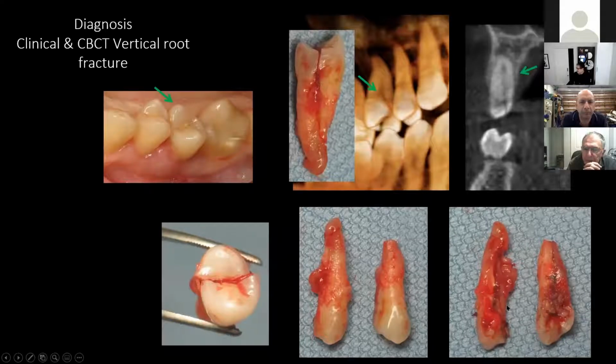So the issue was that the patient was promised, look, go to Dr. Narbani and he will place an implant for you, which I'm happily doing. I'm always grateful that we get referrals coming through the door and happy to look after our patients. But my question is, could this have been prevented? You see, this is why diagnosis and treatment planning is so important. Everything starts from a small area. Everything starts small and gets bigger.